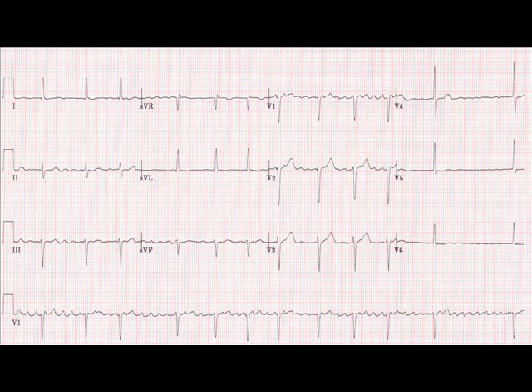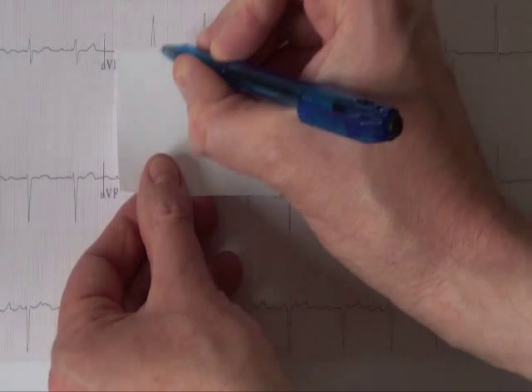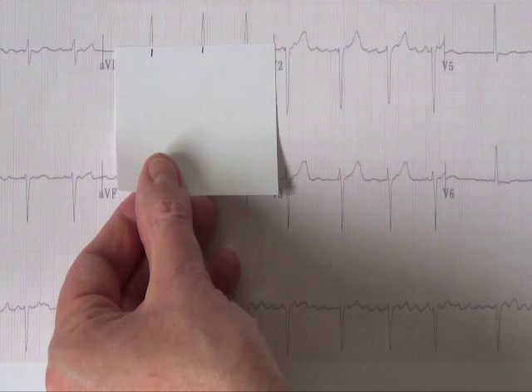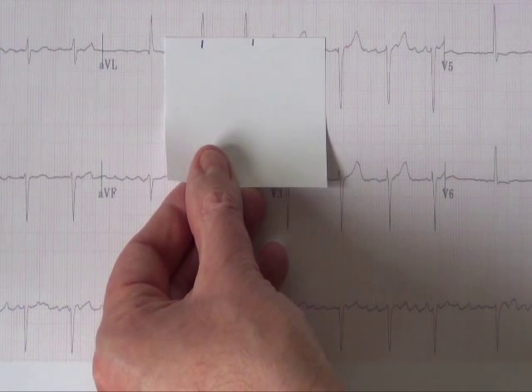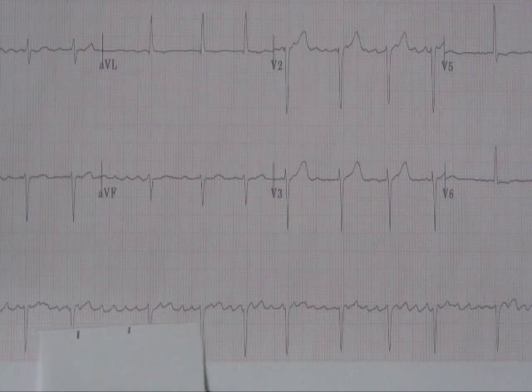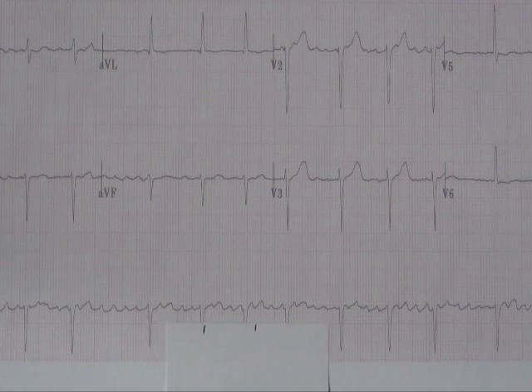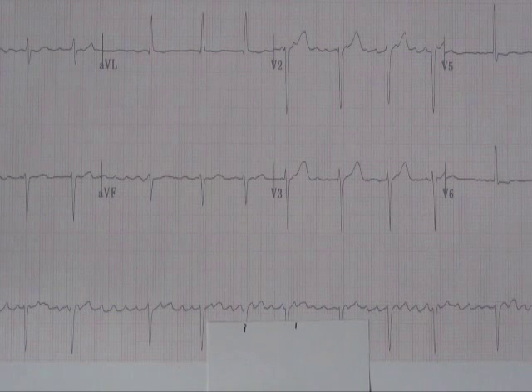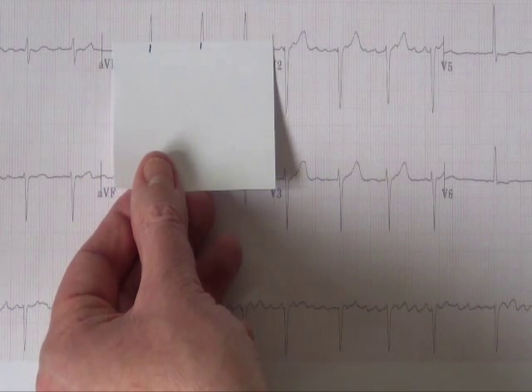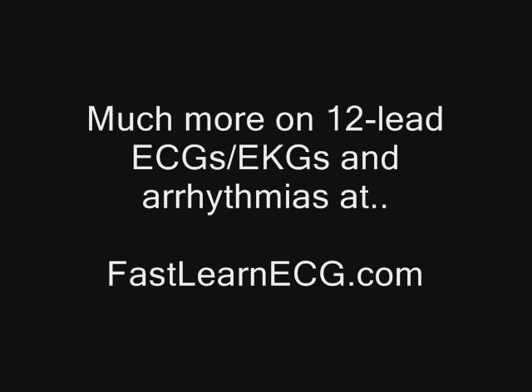To find out whether the heart rate is regular, place a piece of paper over the 12-lead ECG and mark off two R waves. Move the paper along so the first mark lies over an R wave — the second mark should correspond to the next R wave. If it doesn't, there is a suspicion of atrial fibrillation, though be aware it could be other things such as sinus arrhythmia, where the heart rate slightly accelerates and decelerates with breathing, usually in younger patients. I'm Dr. Richard Hatchett for FastLearnECG.com.